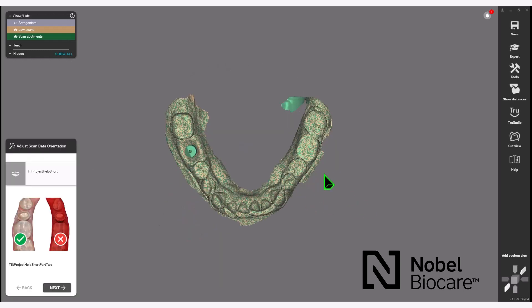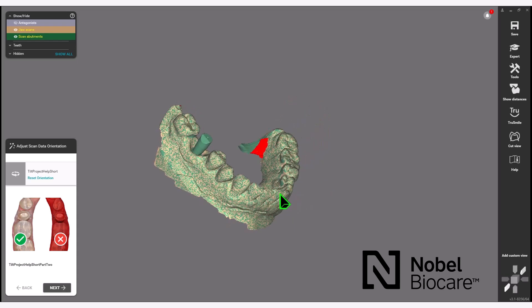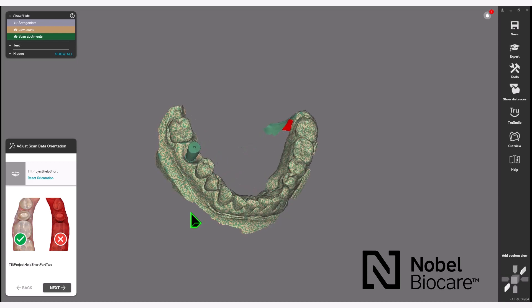Once the STL files have been loaded for the case, proceed through the wizard first on the Adjust Scan Data Orientation step. Click Next in the wizard to proceed.